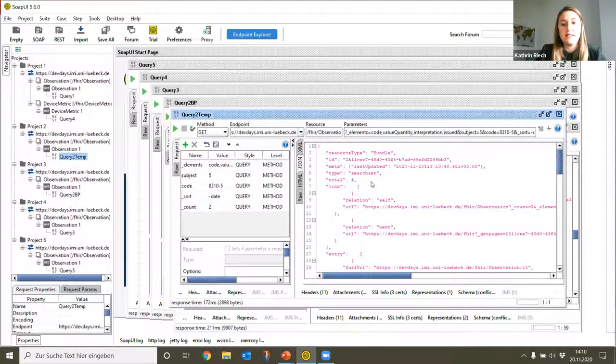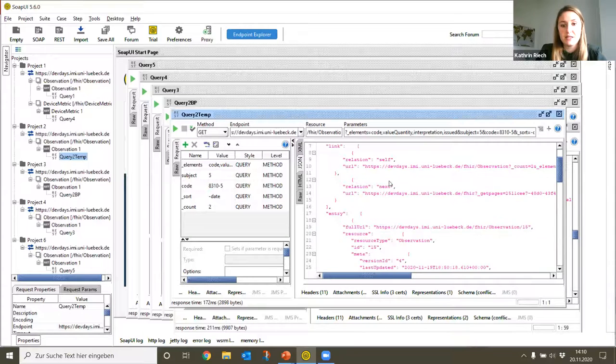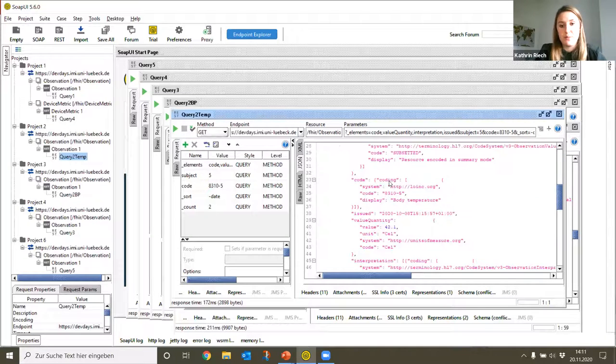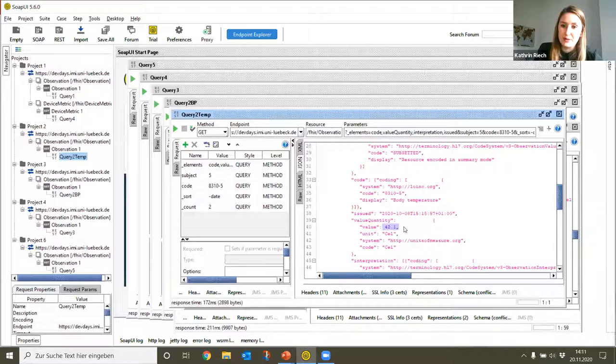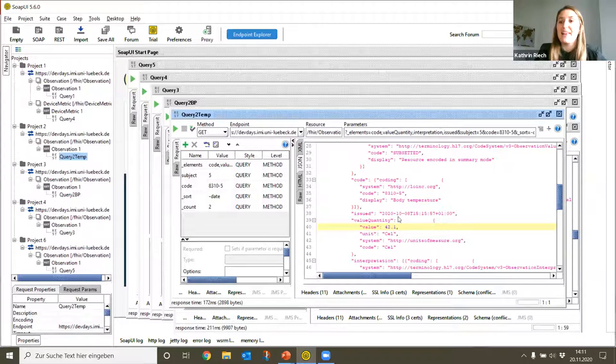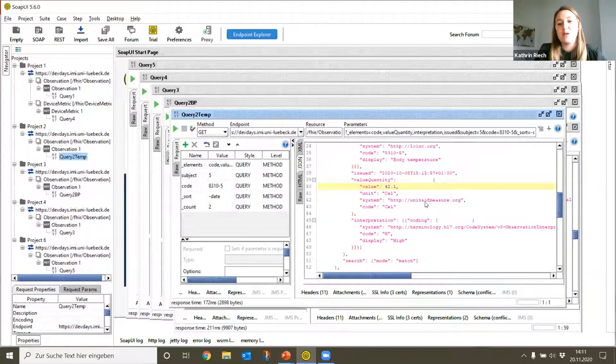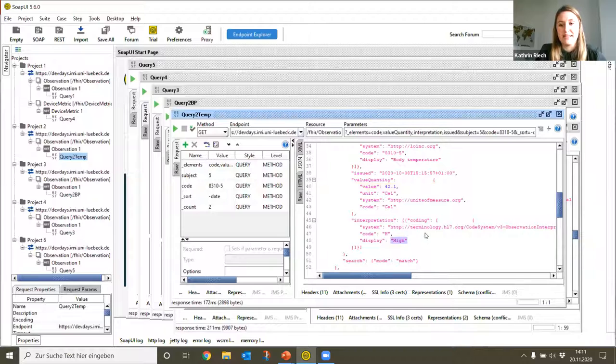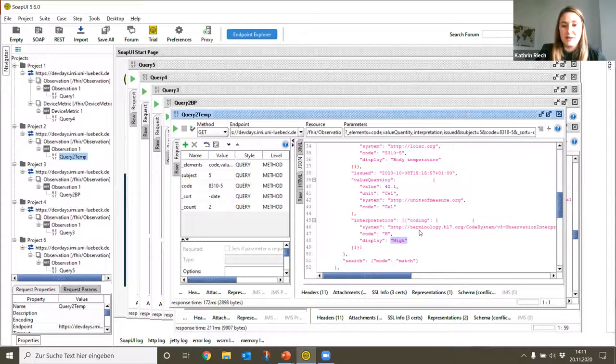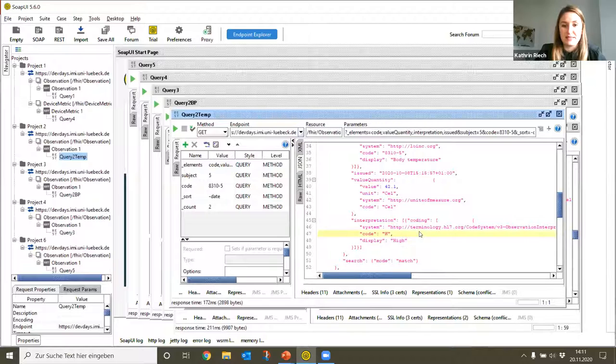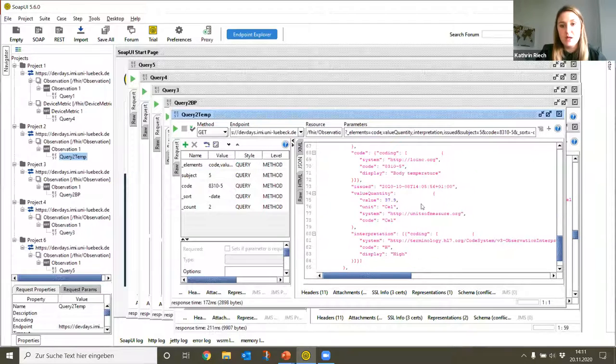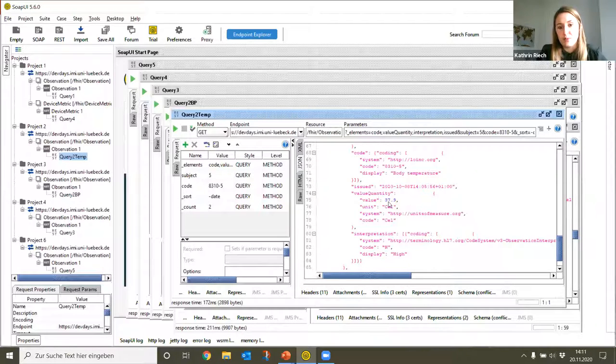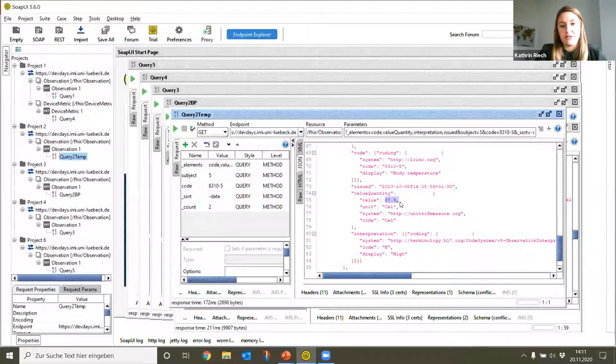As you can hear, in total there would be six resources that match our specifications, but only two of them will be shown. As you can see here, the actual body temperature measurement of our patient lies at 42.1 degrees, and this is really really high. So let's all hope for our patient that this isn't true, otherwise she would be really sick. Let's hope that this is only a measurement error. Only one hour before, the body temperature lay at 37.9 degrees.